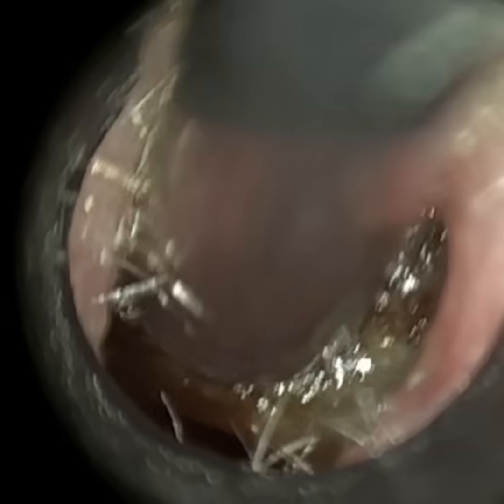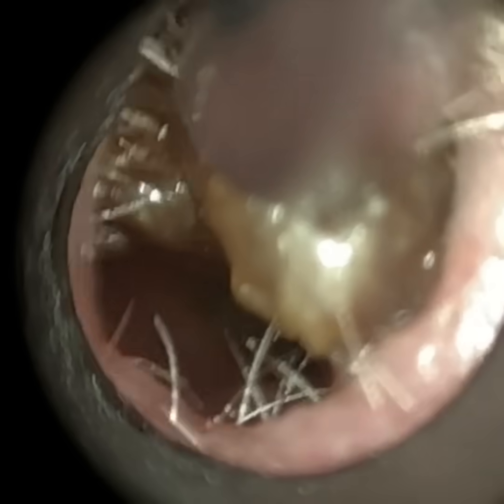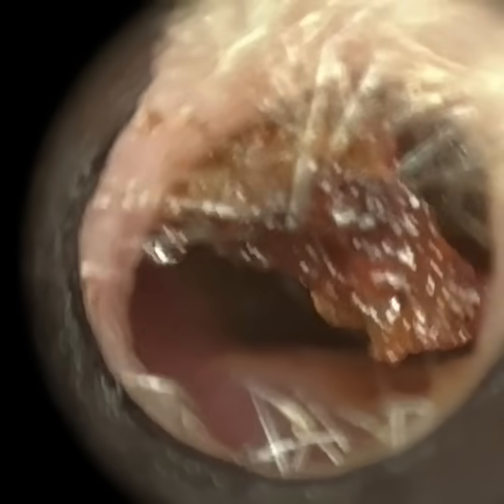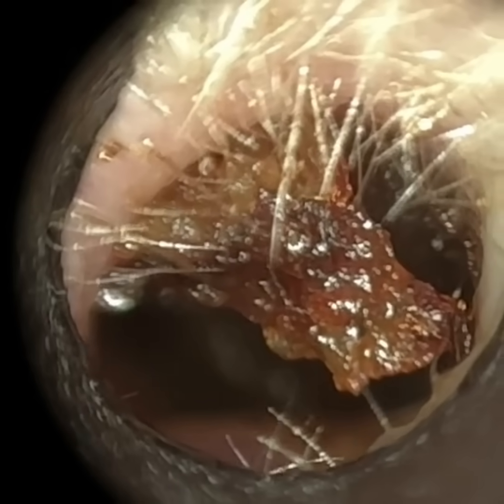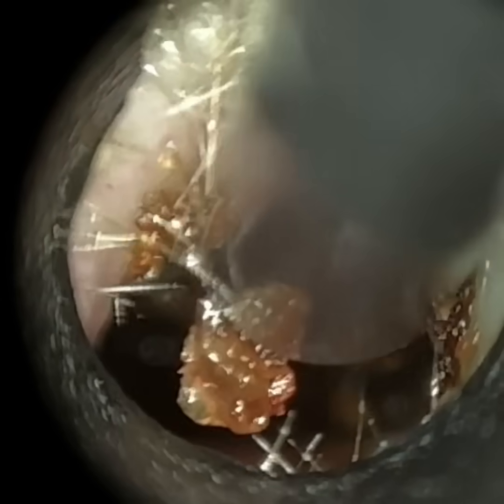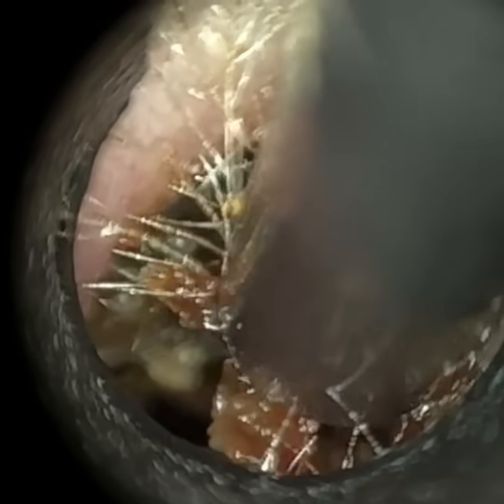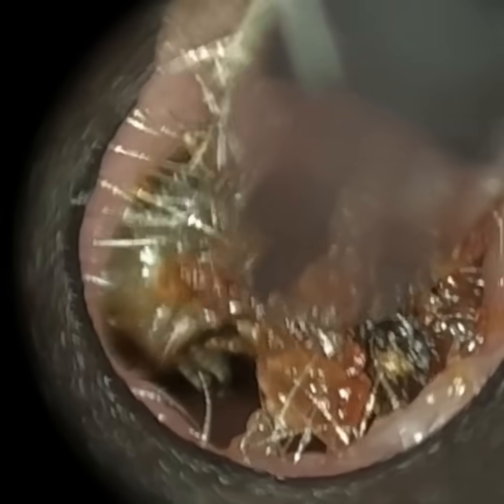The less sound that's reflected out of the ear, the better the middle ear is working because it's absorbing that sound, and the more sound that's reflected, the less well the middle ear is working because it's reflecting it out of the ear. So in this patient's left ear, almost all the sound that we're playing into the patient's ear was being reflected back out of the ear. So that confirms a conductive hearing loss, where the sound is not being able to be transmitted through the middle ear. We then performed a test called tuning forks.